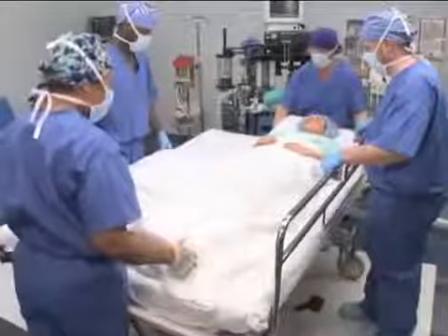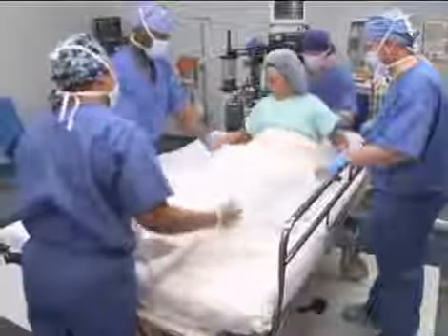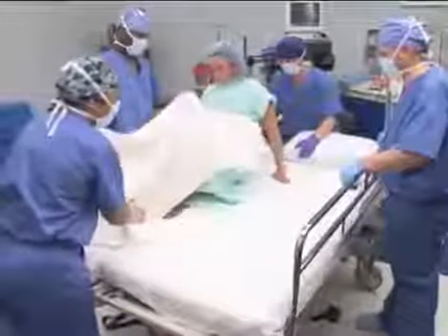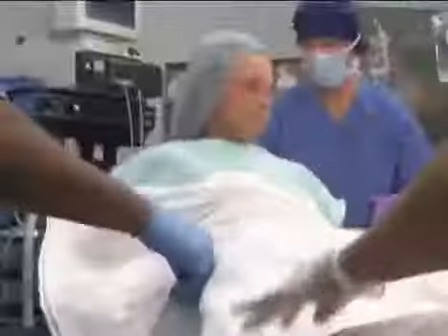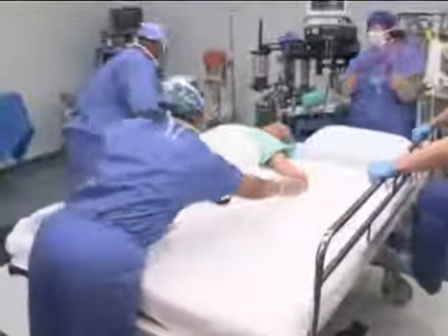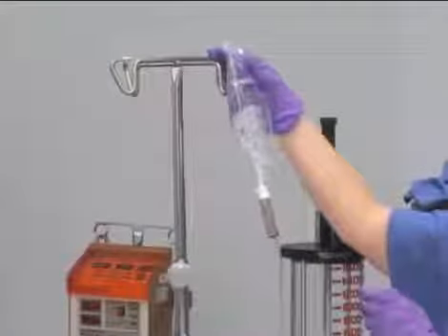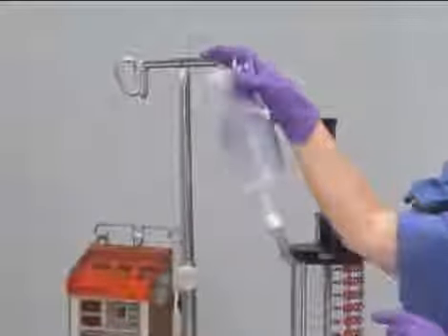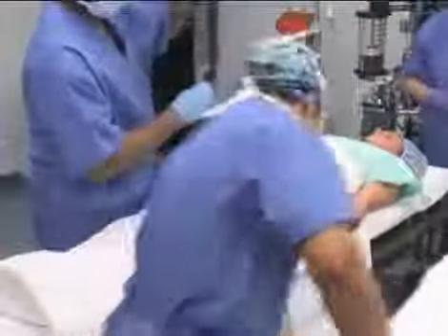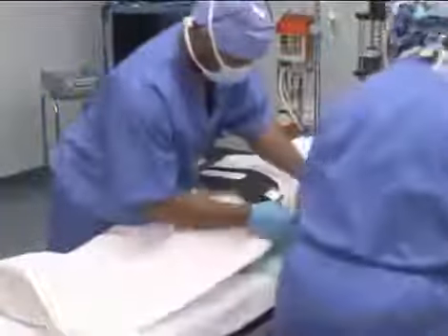Begin by freeing up all tubing and monitoring leads to allow slack during the move. One person should assist with the feet, while 2 others assist at each side of the patient. Transfer drainage tubes, IV bags, and other attached medical equipment items. Ensure that IV lines and drainage bags are all secured before unlocking the stretcher wheels for removal of the stretcher from the room.